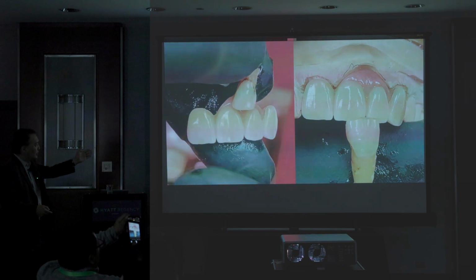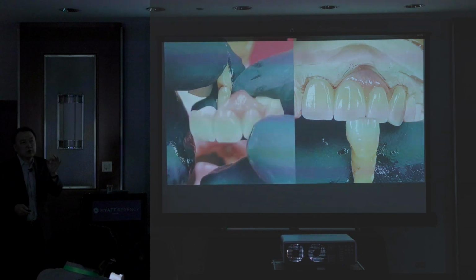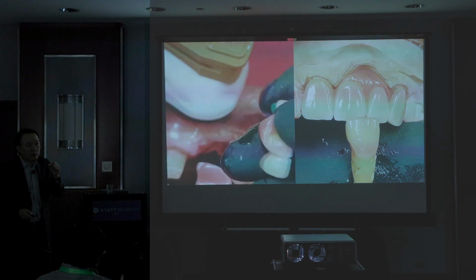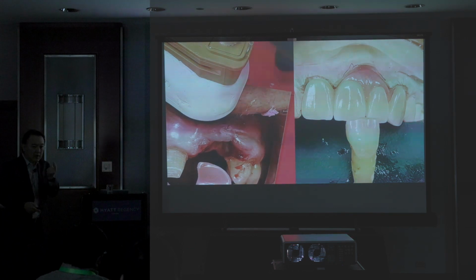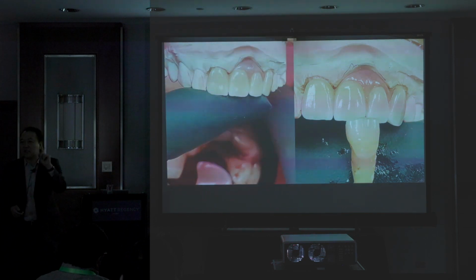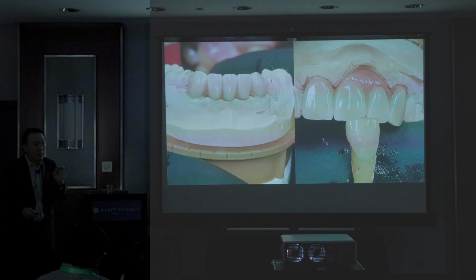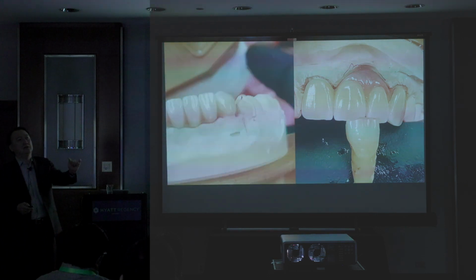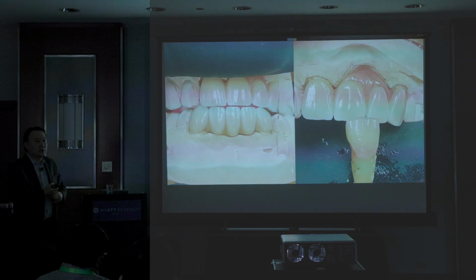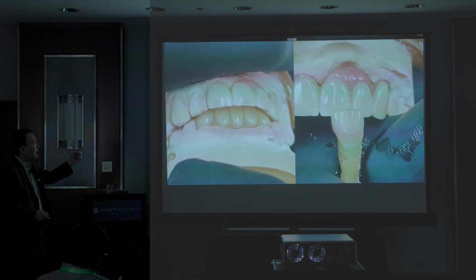before cook, after cook, matching the surface texture, because a lot of people don't know it's very important. When you put a lot of stain, a lot of glazing, it's not going to match. For example, whenever I see the crown or veneer in my hands and it's too bright, it just reflects, and this is not going to match in the patient's mouth even though you made it perfectly. Why? Too much reflection. So whenever you put it in the patient's mouth, ooh, something's not right. So we have to concentrate on surface texture, which is temperature. Glazing temperature, you can check that one.